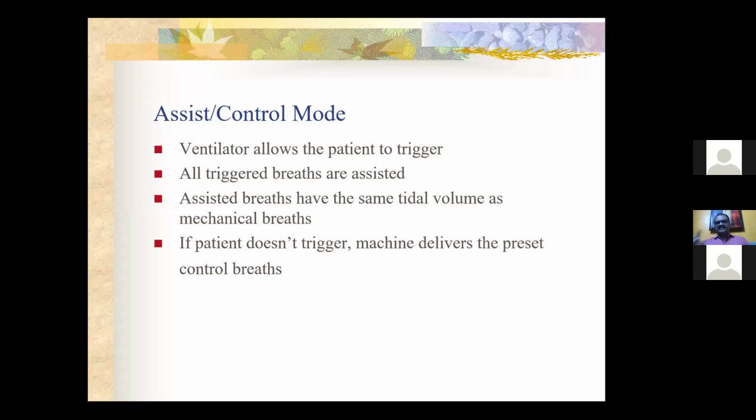depending upon the respiratory rate, if you are setting a respiratory rate of 15, then in 1 minute it will be giving a breath every 4 seconds. So the machine will first give a mandatory breath, wait for 4 seconds, and see if the patient is triggering in between. If the patient is triggering in between, it will support with a mandatory breath. Otherwise, after 4 seconds, it will give another mandatory breath and goes on till the patient is able to trigger it.